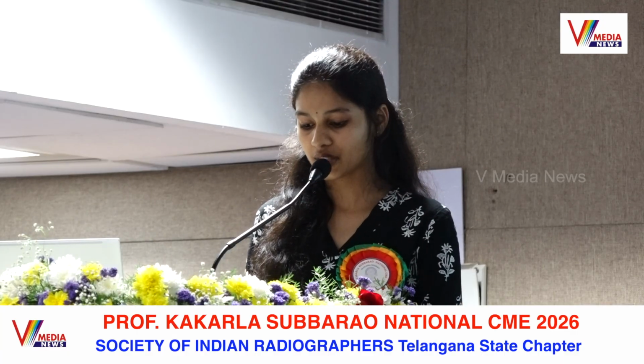Next we'll move to DSC perfusion imaging. DSC stands for dynamic susceptibility contrast, which means we measure the blood flow in the brain tumor. For a tumor to grow, it needs blood supply, right? So we measure the blood flow in the tumor with the help of the parameter called rCBV, which is relative cerebral blood volume. Here in the image, the appearance of red color shows us the malignancy of the tumor.